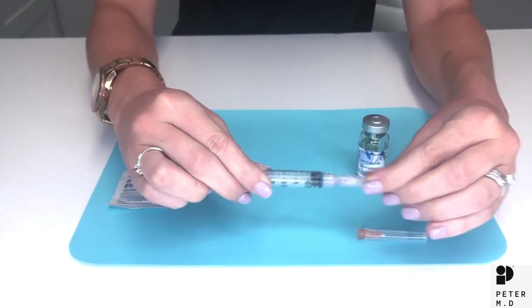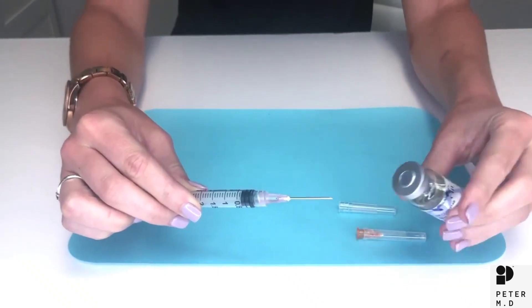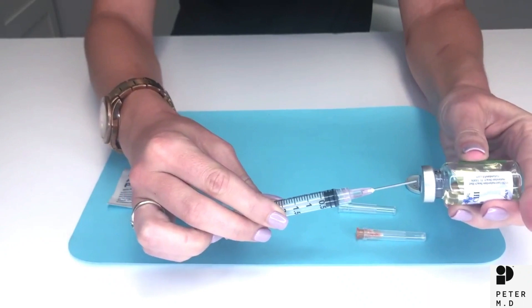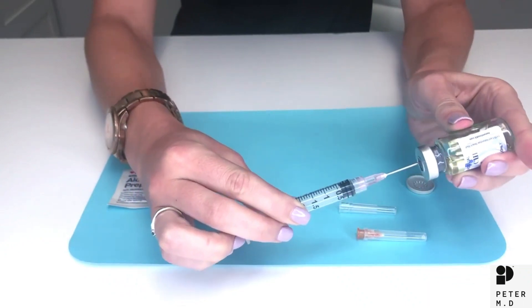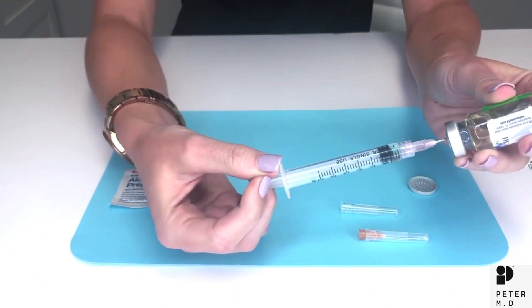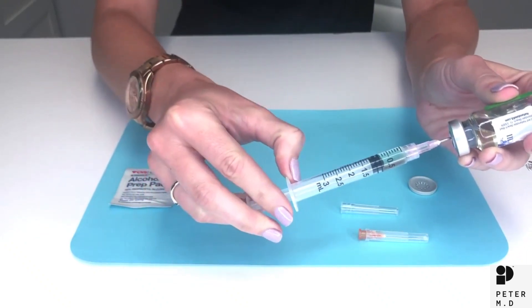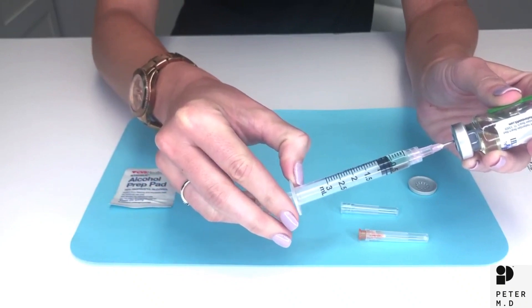Next carefully uncap the needle. You'll take your testosterone vial, turn it upside down, and insert the needle in the center of the rubber cap. Slowly pull back on the syringe until you get to the correct dosing for your prescription. So if it's half a cc it'll look like that.